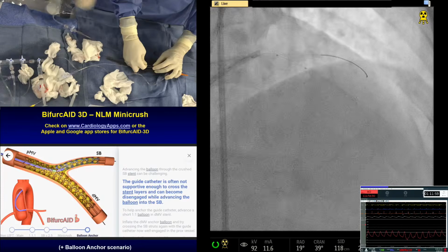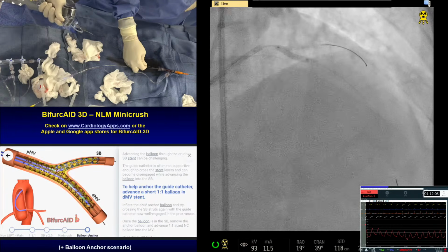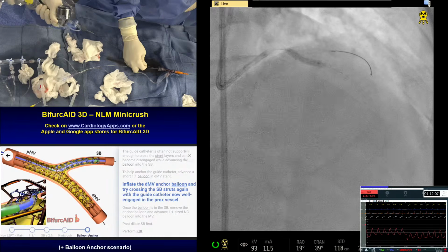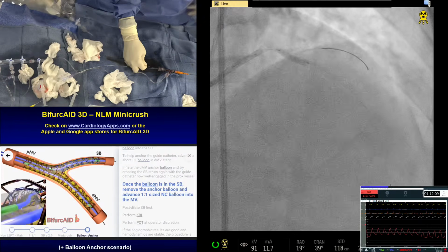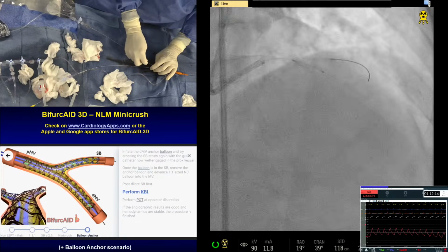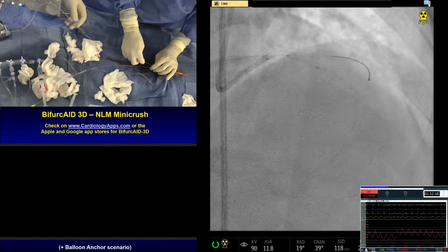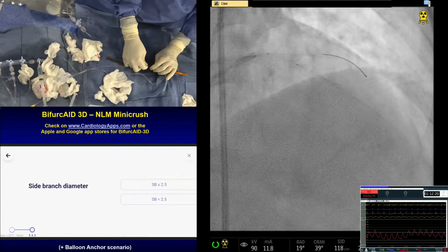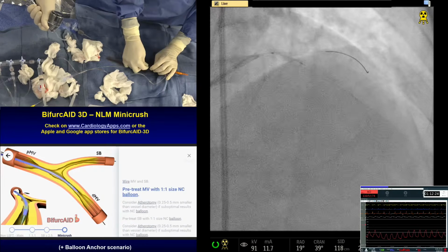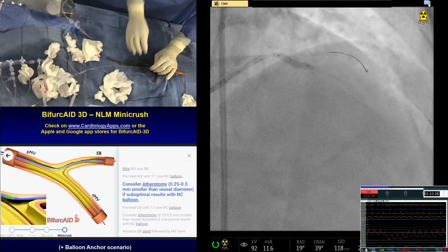Okay, go up. So it's not truly a POT, because POT basically means you are before the bifurcation. And it's not before the bifurcation, we are just opening the cells of your earlier 3.0, which you do post dilatation. And now, since we open, I think it should have been a little more proximal to open the cells. No, we don't need. Yeah, good here. Yeah, let's open this. Okay, good. Okay, down.